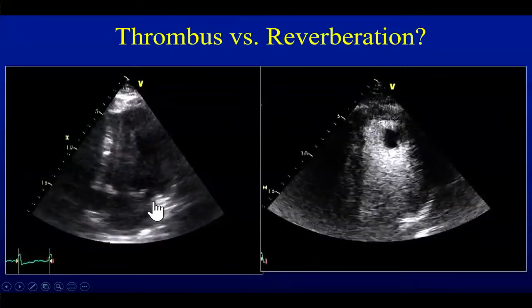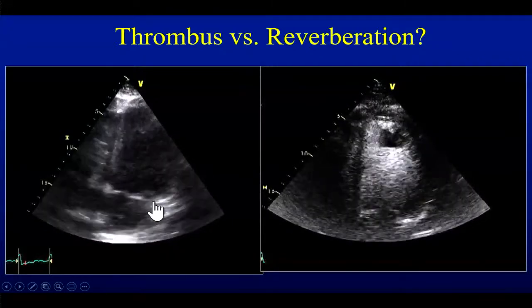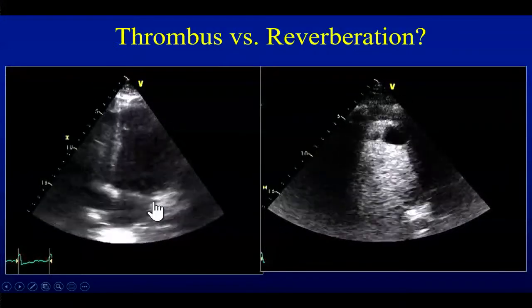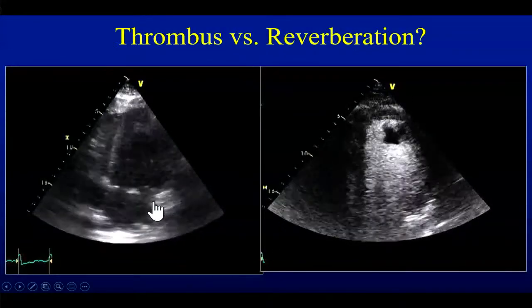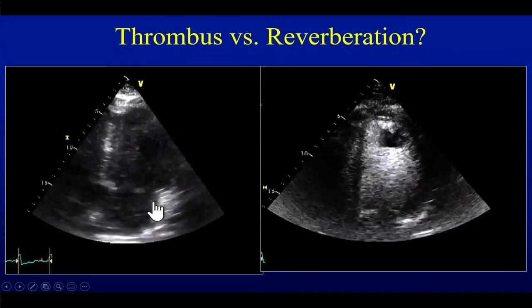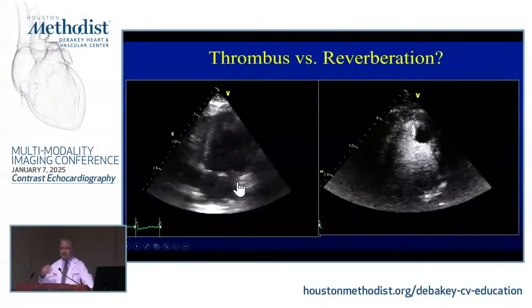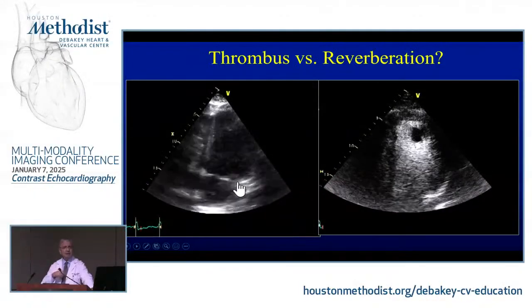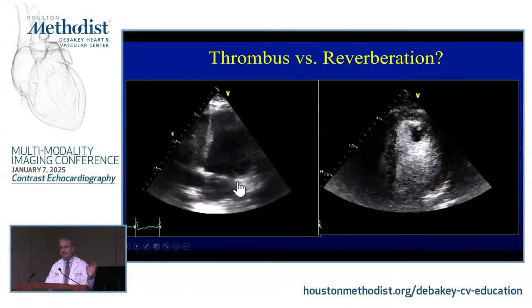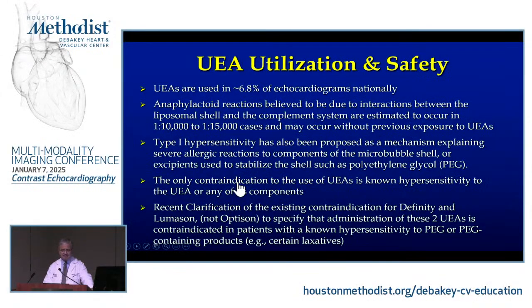We trust our sonographers. I think they do overall a great job, because from the early days, the feedback of "you overused it" versus "you underused it" is much less nowadays. And if you feel contrast will change your diagnosis, it's okay to call the sonographer, if the patient's still here, and say, do you mind doing the contrast? Because we're looking for this and this and this, as opposed to leaving it, wishing we could. So I think you should do that.